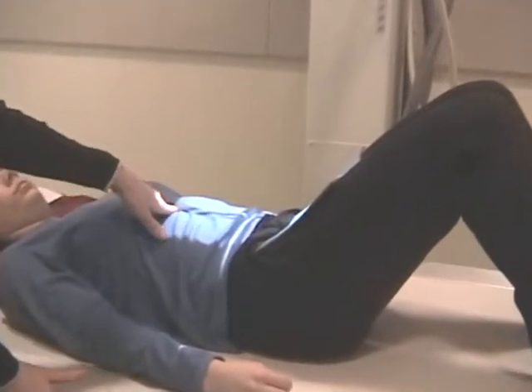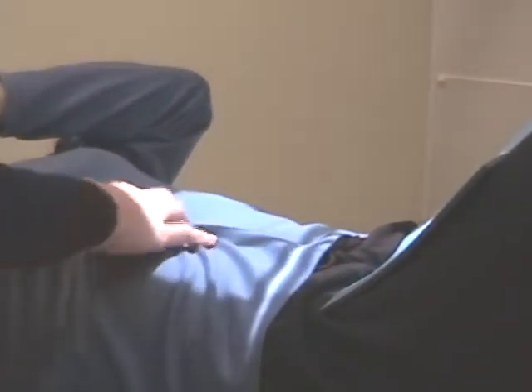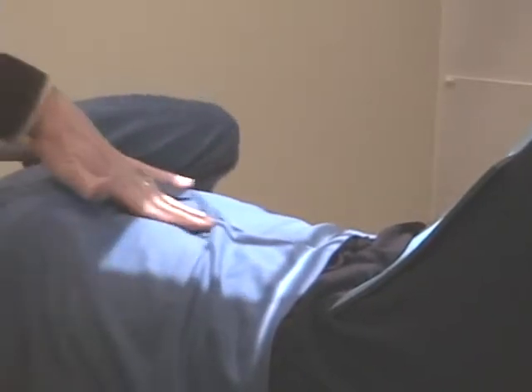And I have my finger on her xiphoid process. You can follow the rib cage up. There's her xiphoid process. That will tell me that the mid-sagittal plane is to the center of the film. I'm using a floating tabletop.